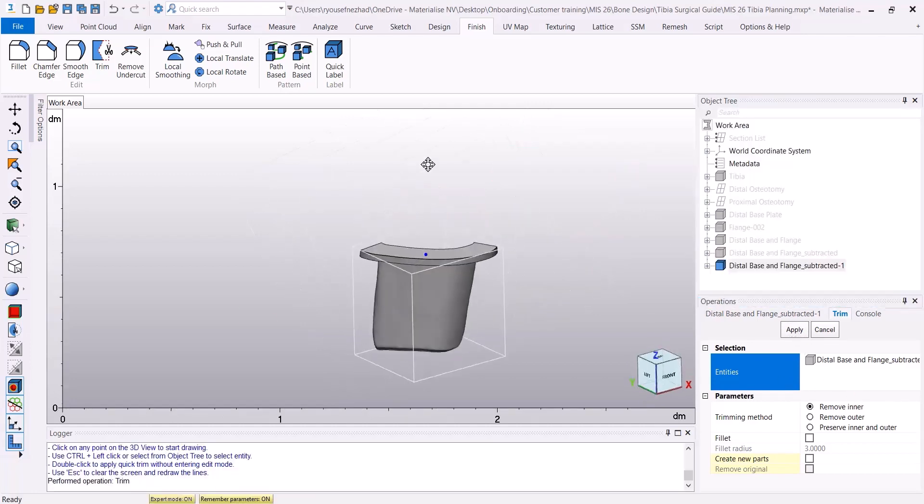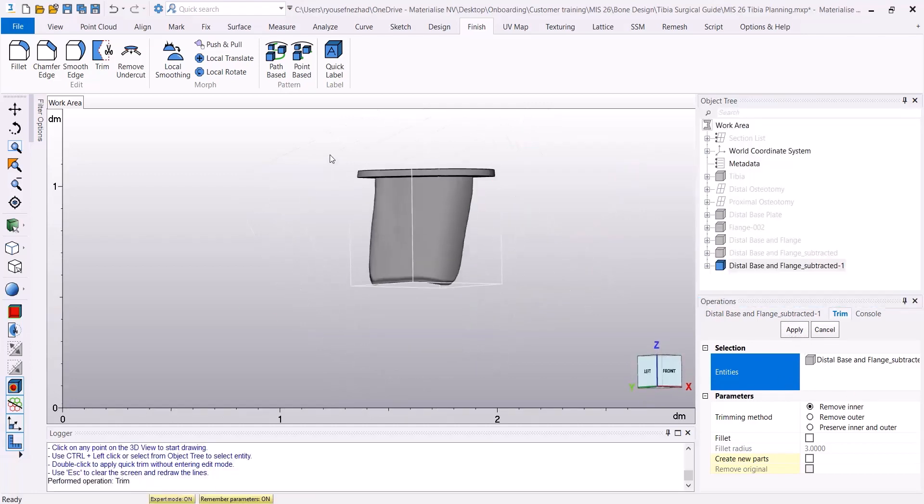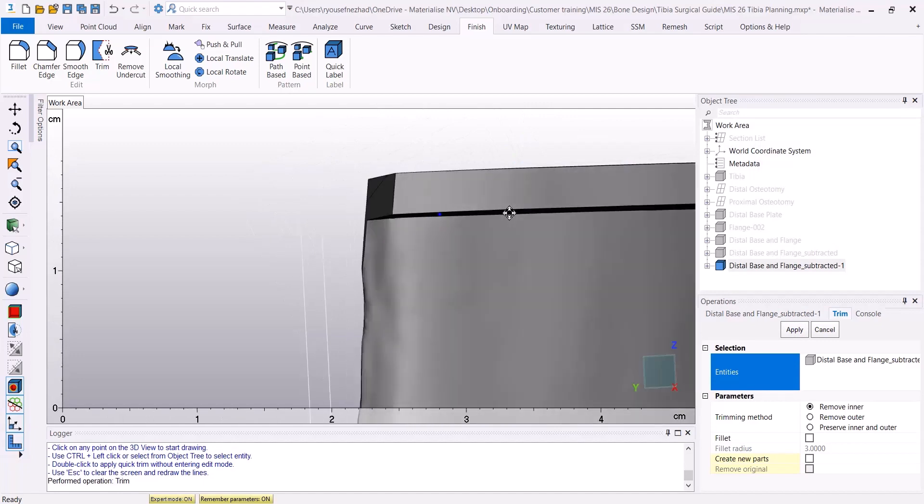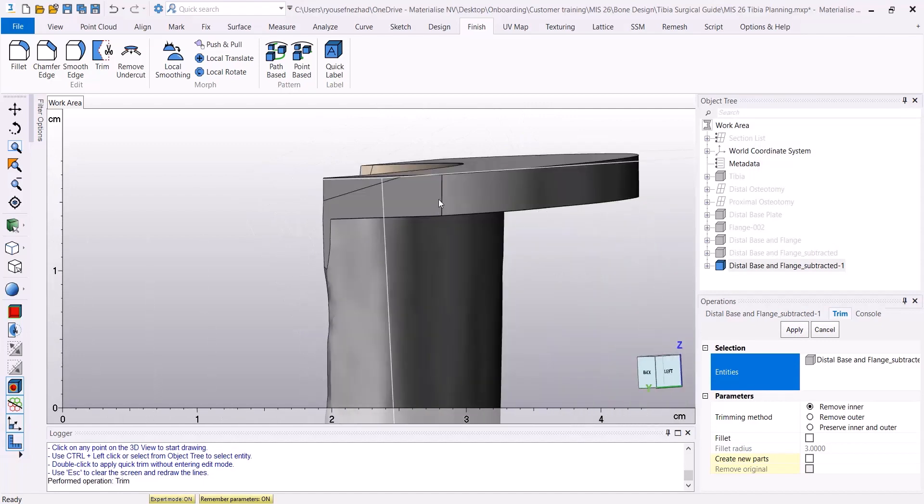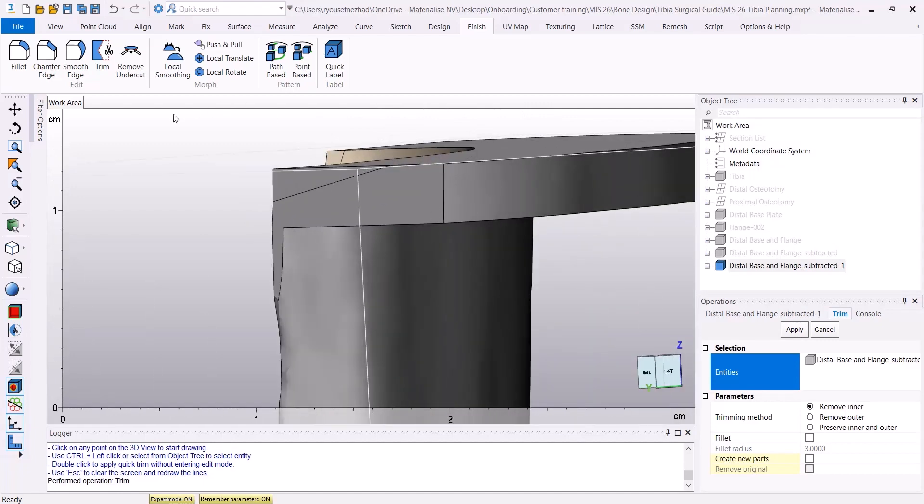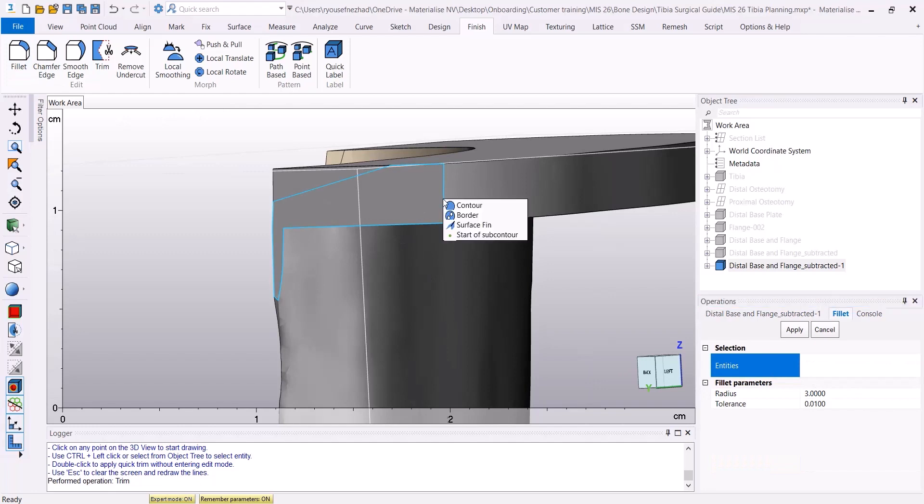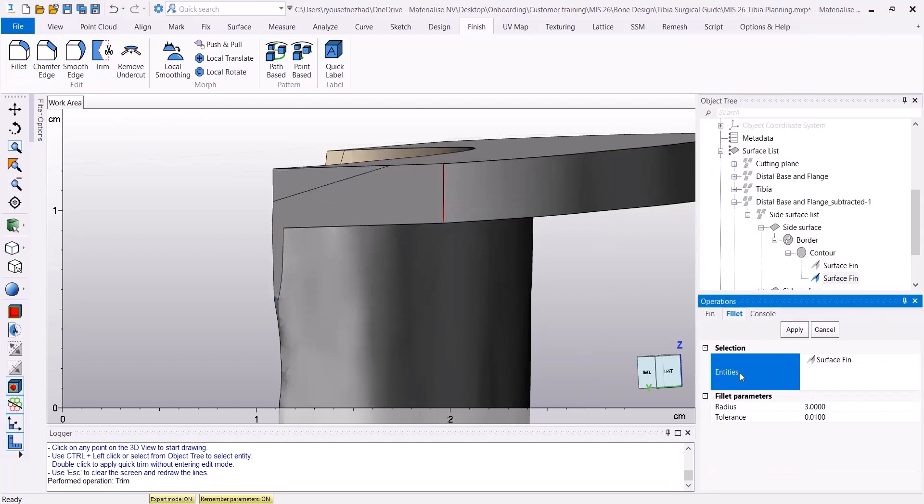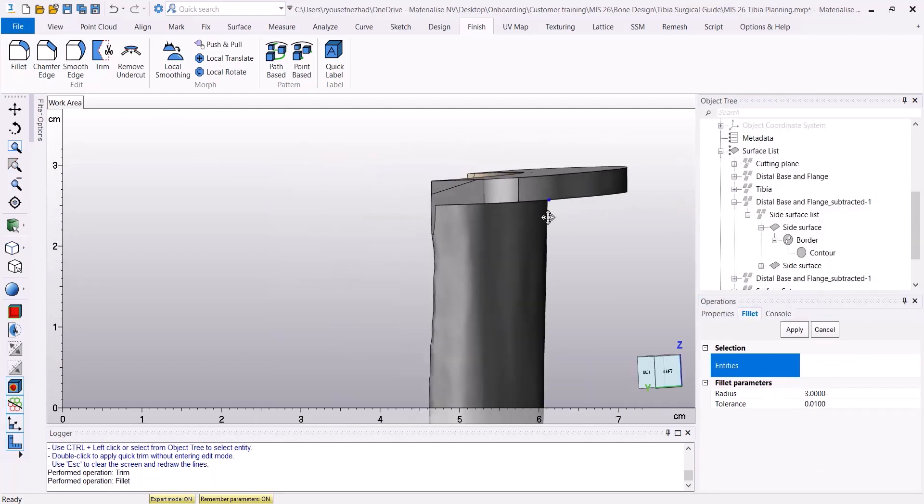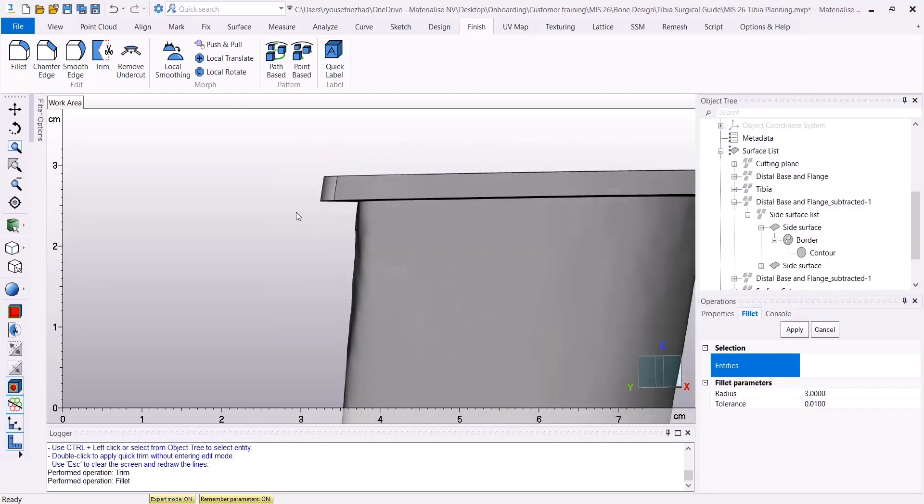As a result, I'm going to have some sharp edges, which can be softened using the Fillet tool. Select the surface fin as the entity with a radius of three millimeters.